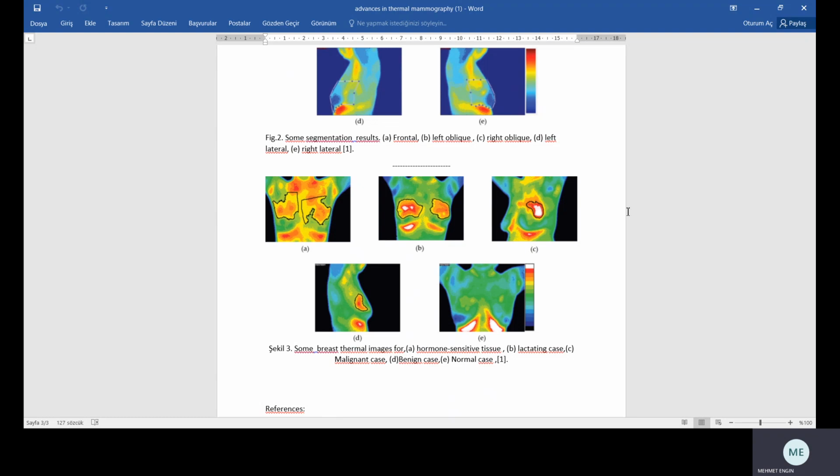The complexity and subjectivity in the interpretation of thermal imaging has been a major deterrent in the wide acceptance of the usage of thermography. Use of computer-aided diagnostics for automated thermography interpretation is just around the corner. With software support, thermal analysis and interpretation can be more efficient, effective, and non-subjective.